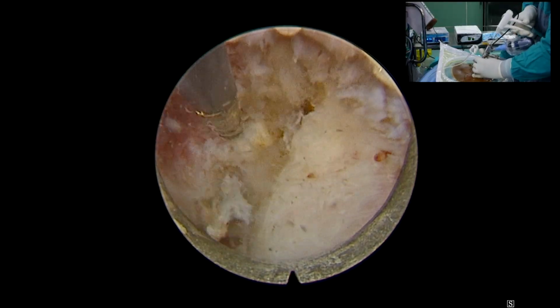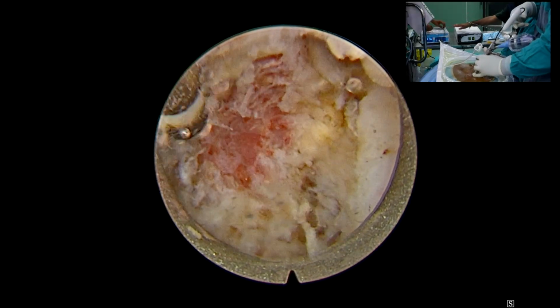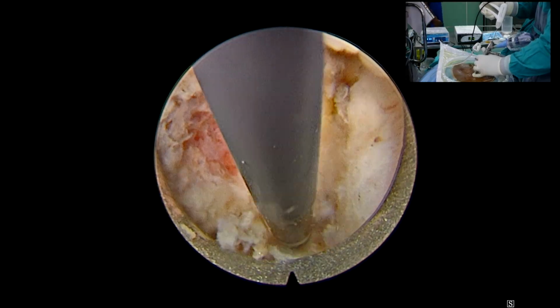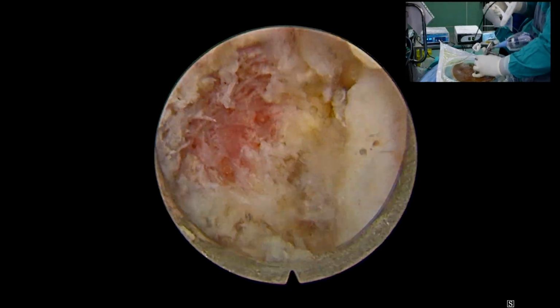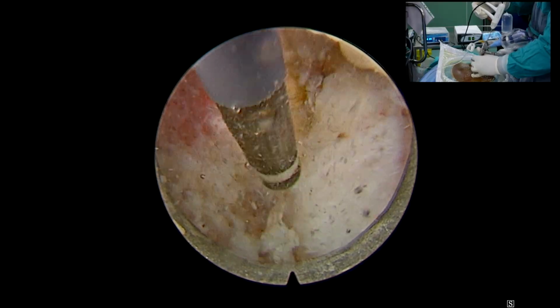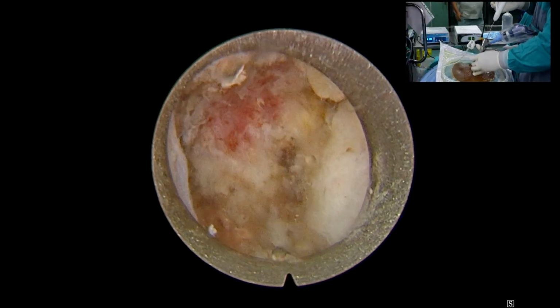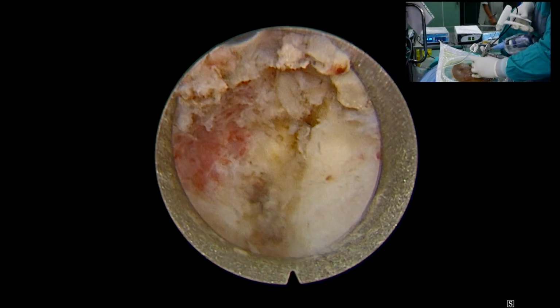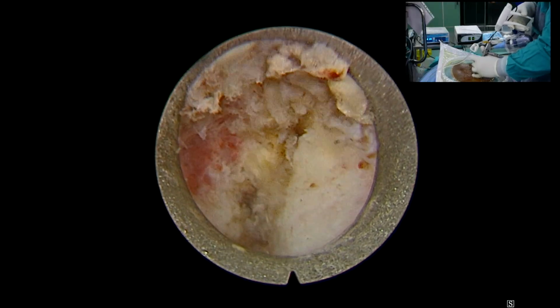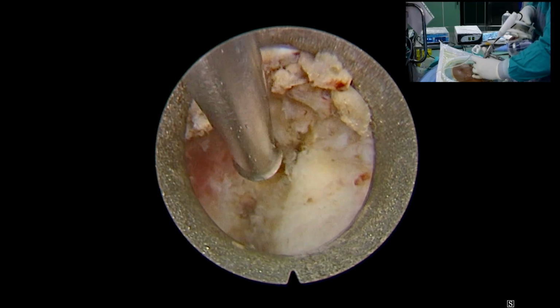See, he's again trying to put it on the bone and drill the bone. Upper lamina. No, we could not make out, it was too close. Wherever he's sitting, that's the upper lamina.